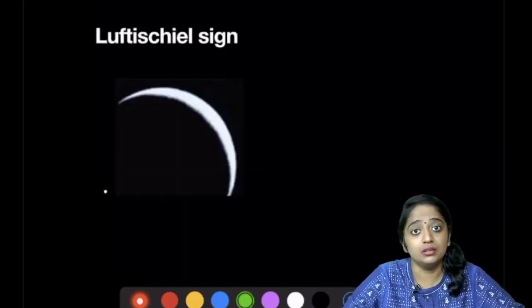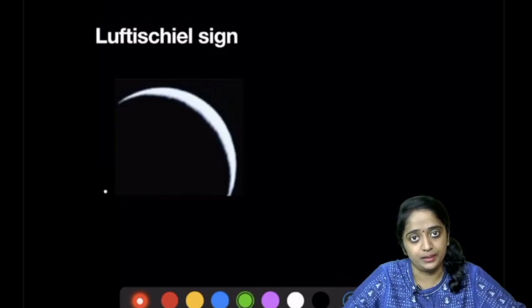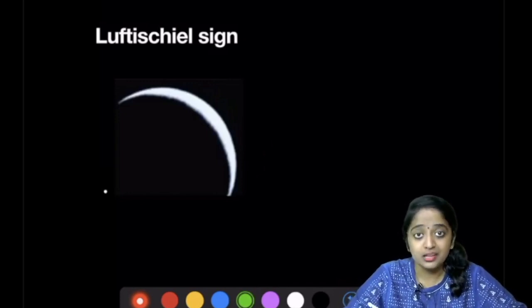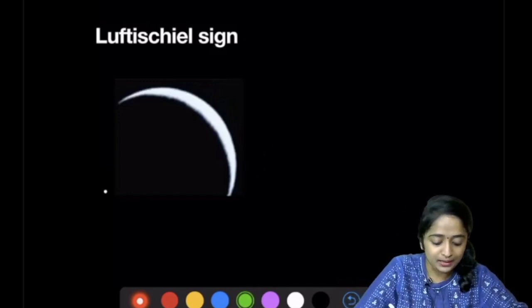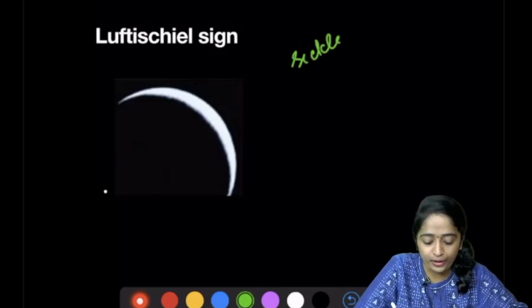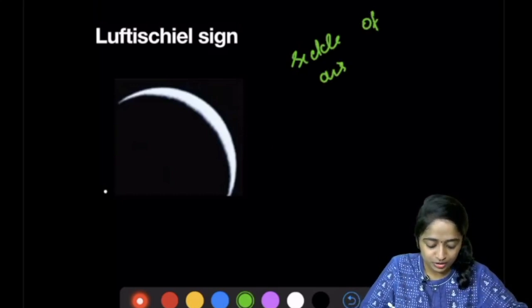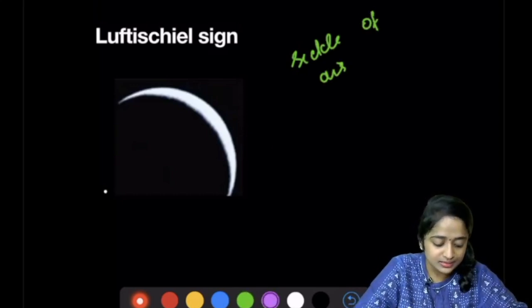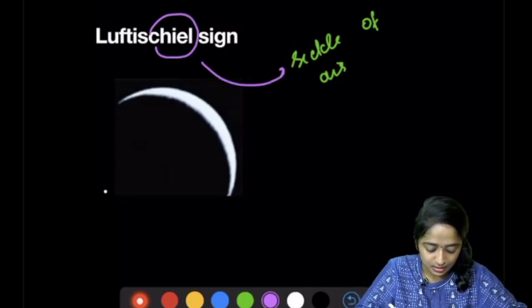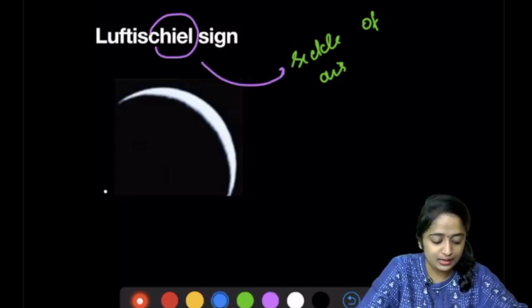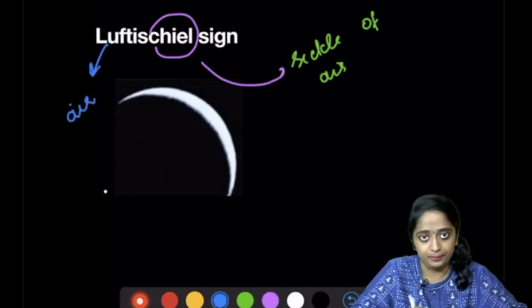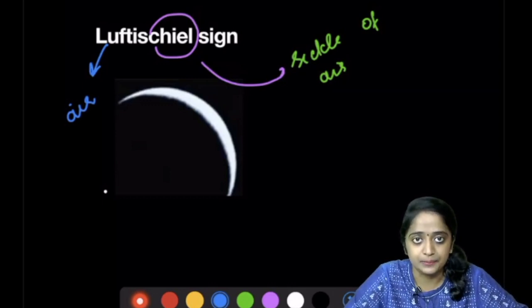First, the Luftsichel sign. What do we mean by Luftsichel? It's a German name — 'Sichel' stands for sickle and 'Luft' stands for air — so it means sickle of air. Let's see where it is seen.